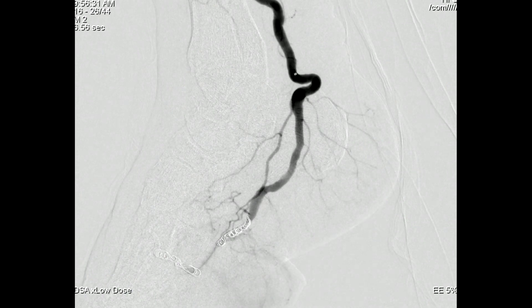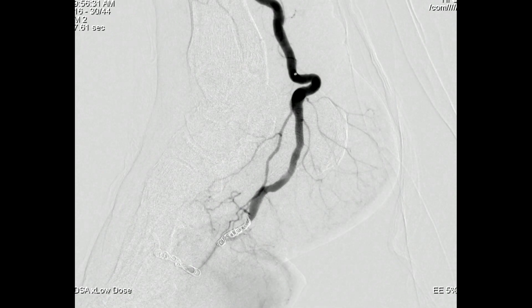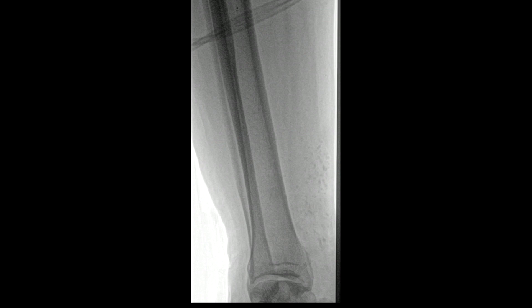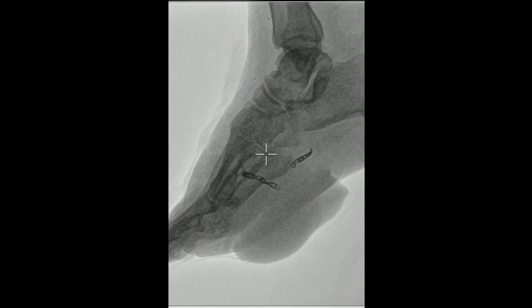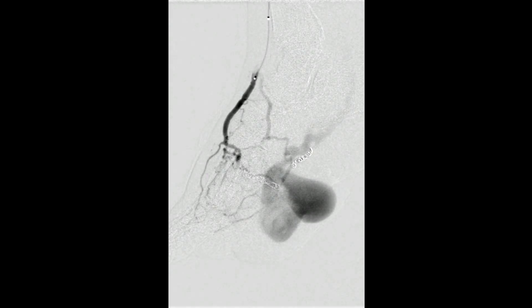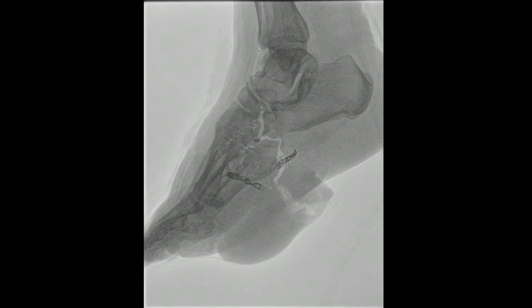If I were to do this again I would immediately put onyx in once the coils are deployed, because even though it looked good, with the patient anticoagulated we came back and saw flow through both vessels. We shot the peroneal artery just to make sure there were no communicating branches — one of the terminal branches of the peroneal filled the posterior tibial, but there was no direct filling of the AVM itself. We then re-shot the anterior tibial and there was a proximal branch filling it. As you take out branches, there's an amazing ability to find alternate pathways to fill the pseudoaneurysm.